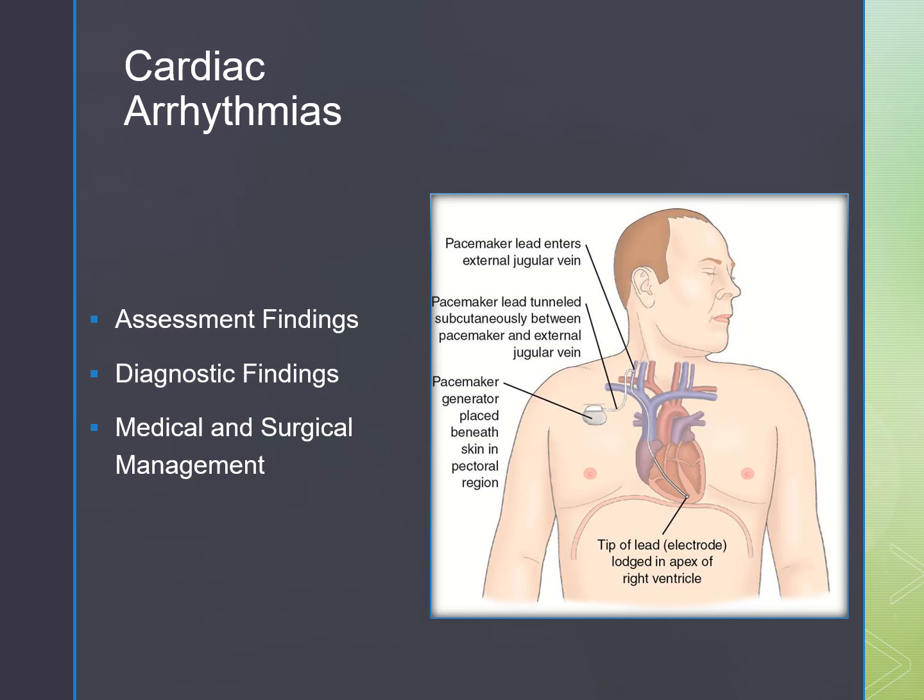So usually for at least the first 24 to 48 hours, we have to immobilize that arm. And this is very important when they may have to go for a postoperative x-ray the following morning. Instruct your radiology department. Do not allow them to pull their arm forward or above their head.